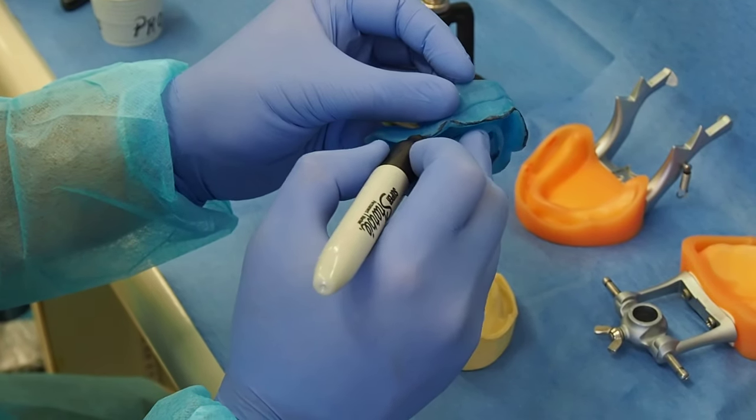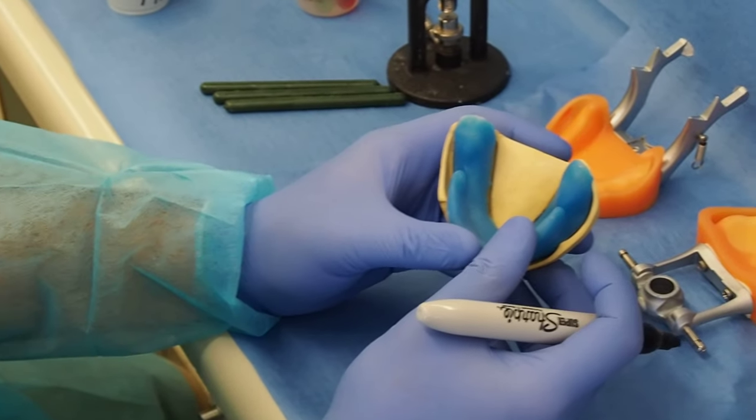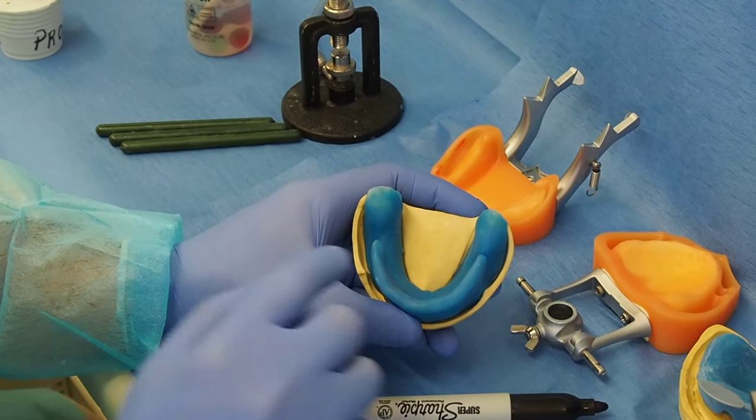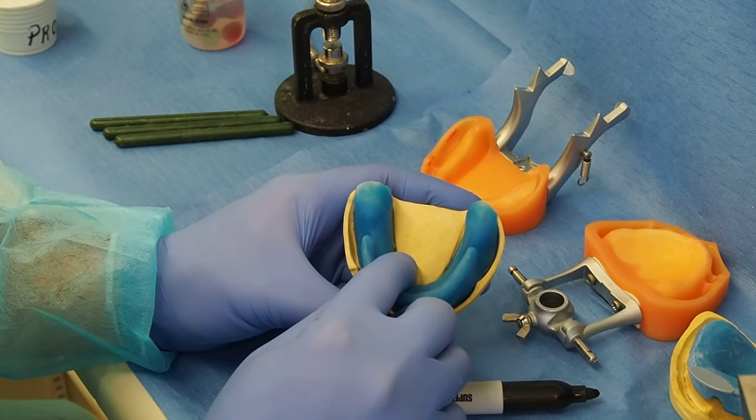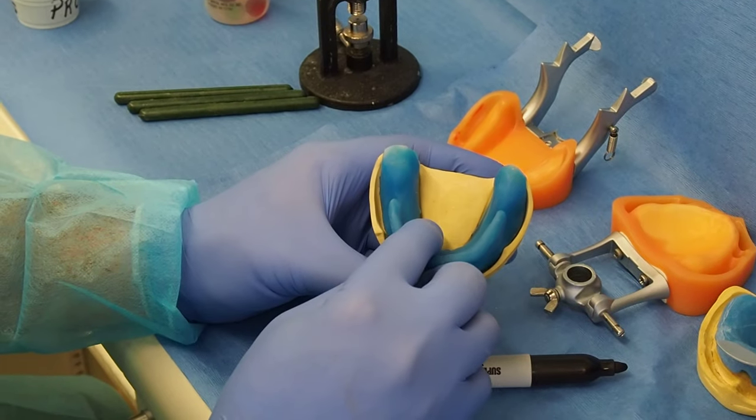And something very important, remember in the back we were talking about the posterior palatine seal. The posterior portion of it, this is completely overextended. If you see there, the retromolar pad.